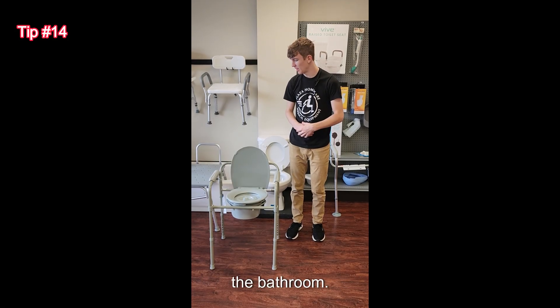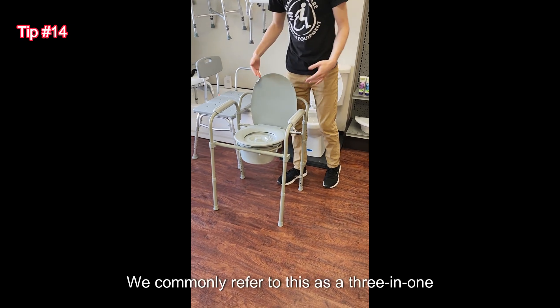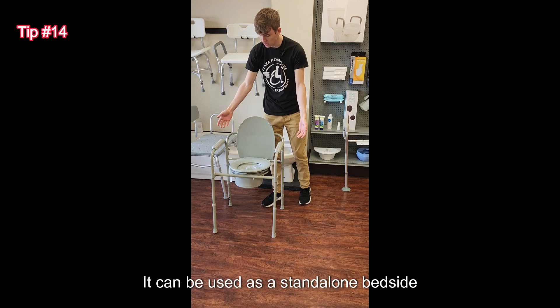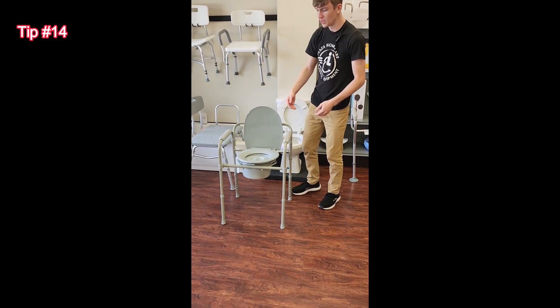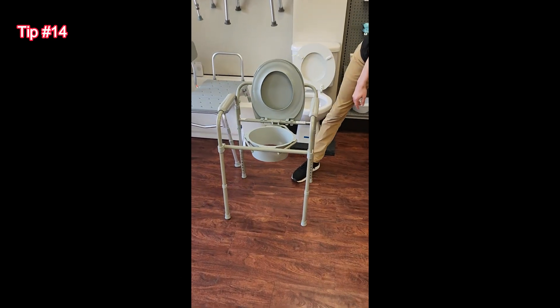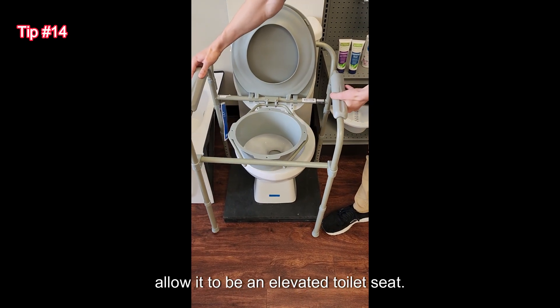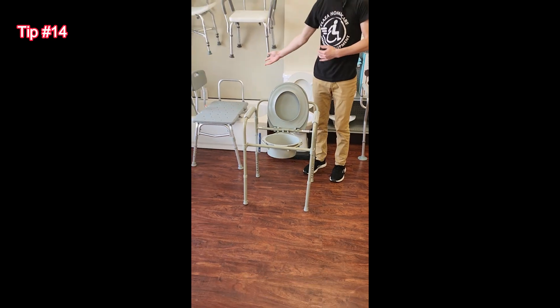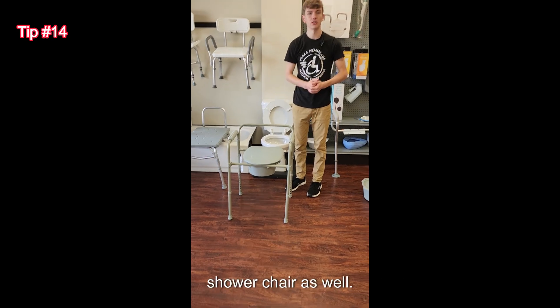Here are a couple of tips we would find in the bathroom. This is a bedside commode — we commonly refer to this as a three-in-one due to its three different functions. It can be used as a stand-alone bedside commode just in the bedroom. You can also remove the bucket from it, which would then allow it to be an elevated toilet seat. And the third function would be a shower chair — you could have this down and it would be a freestanding shower chair as well.